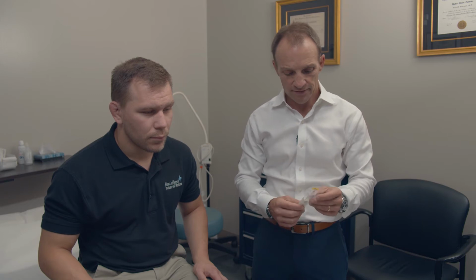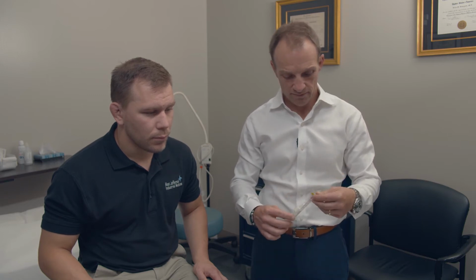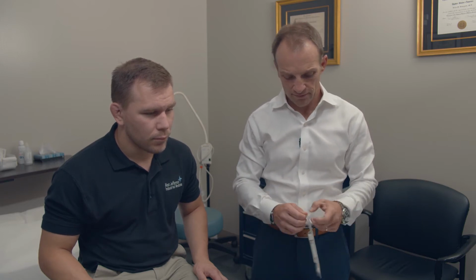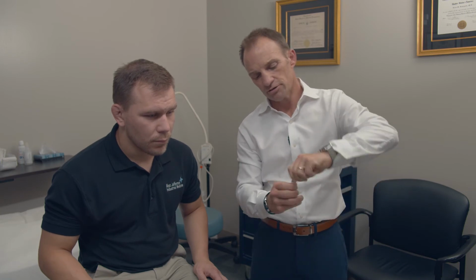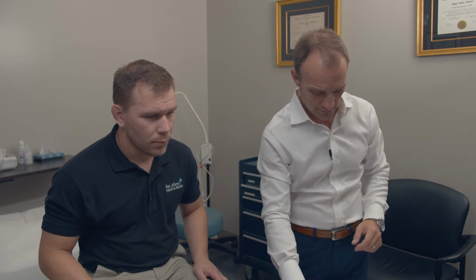Next part is what you should do with this initially. When you first open this, peel it open partly. Leave the swab in place. We don't want to contaminate the tip. You can open a little further, and you can simply take the vial out. Keep the swab in the container. Once again, to keep it clean, you can loosen the top and just tighten it on gently, for ease of access. And put that on the side.